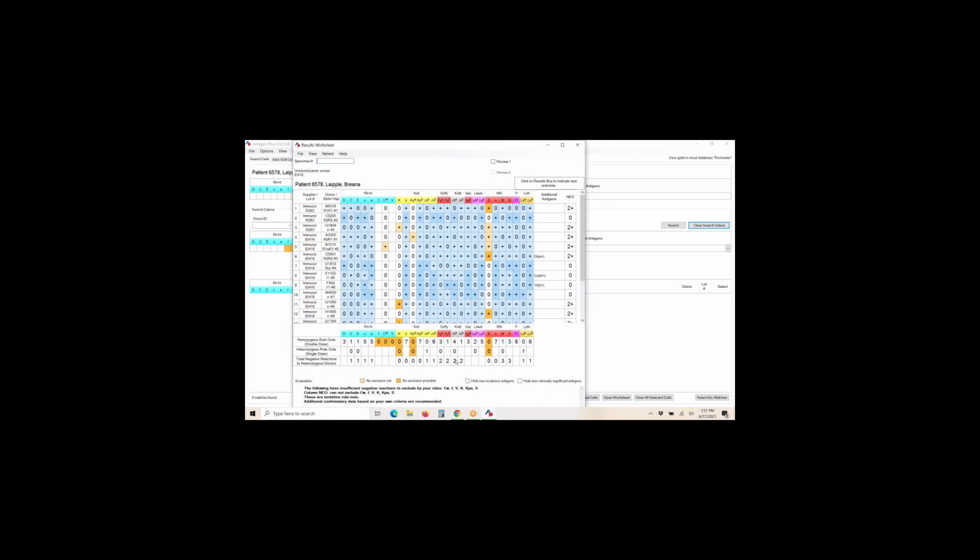Yeah. So once we have our screen and our panel done, we look at our screen. We just kind of save and that's it. We look at our panel to get an idea. That's how we do it in the reference lab. And then we're going to go ahead and load our saved panel. And you'll see the top 2, since we just did them, are going to be the ones we did. If there was a lot of other work going on, you would just select your 2. You can do control and then select, or you can just do shift and arrow down at the same time and select more than one. So either way, you can select both the lines you want to merge, and you click on merge, and once you merge them together, you're going to have one continuous panel that has both the screen and panel together.